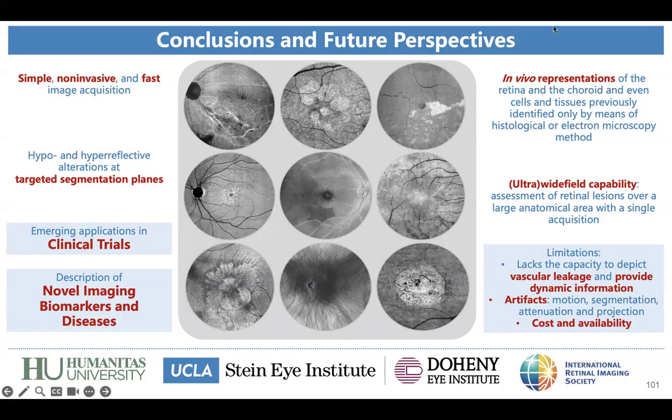I don't know if you get the idea or the intention, but are you aware of any way to make a correlation within the device?